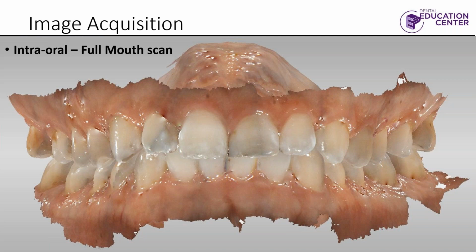There's a lot of stuff that you end up being able to store that you just never really stored in the past, which initially doesn't sound like that great of a thing, but when you start running into those situations where, gosh, I really wish I had a pre-op model of this because the patient came in already missing half their tooth, now I've got those pre-op models on hand that I can use for whatever it is that we need for that particular case.